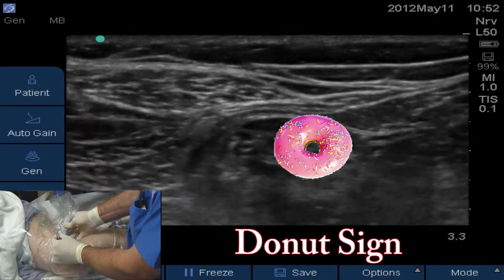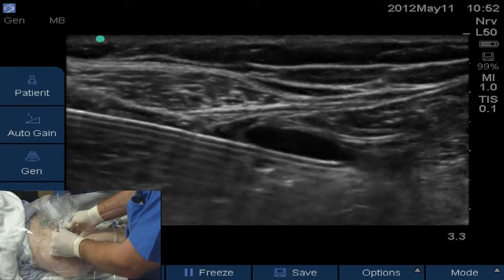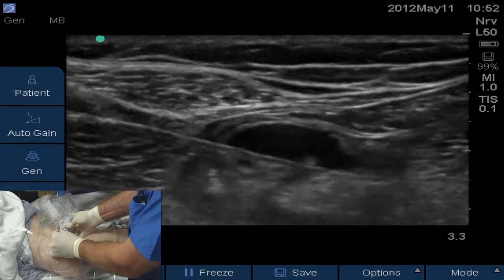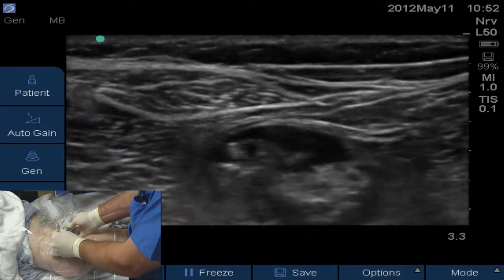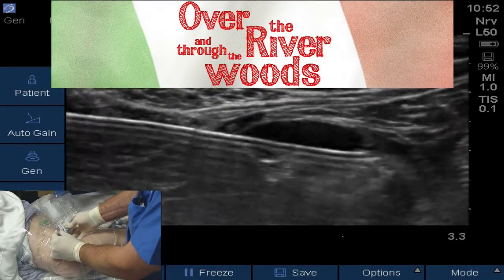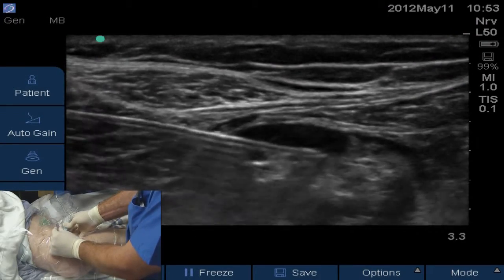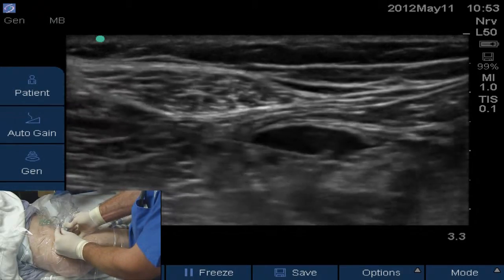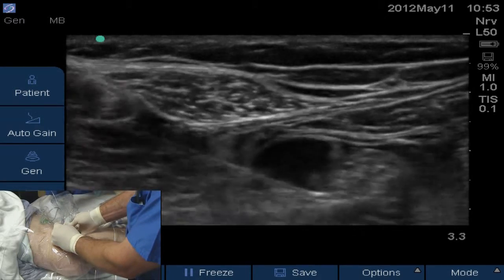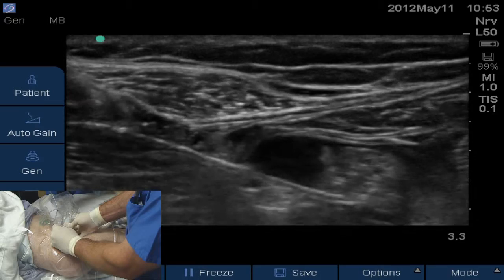I'll slide back up to see the needle in plane and come back over the top of tibial, past peroneal. Now I've completed the circle around the tibial nerve, which now has a circle of local anesthesia around it. I'm going to use the 'over the river and through the woods' technique — allowing my needle tip to go over the top of peroneal nerve and then under tibial nerve, pulling back a little bit, pushing up on the hub to dissect back underneath tibial. All that local anesthesia that backflows along the catheter should infiltrate both nerves well.